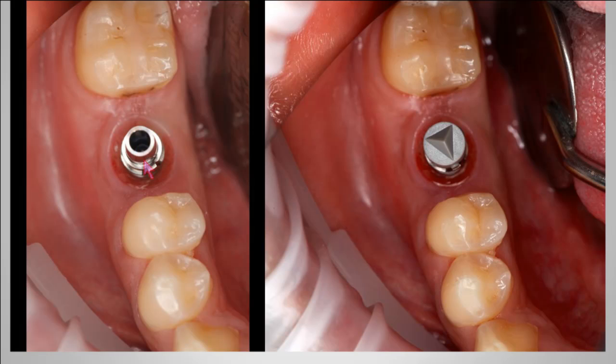Once we've seated this scan post, it's appropriate to take an intraoral X-ray to confirm that the scan post is seated properly. Once it's confirmed, we can then visibly identify this notch and seat the scan body, lining the scan body notch exactly with the notch that's on the scan post. With this component completely aligned, we are now ready to take an optical impression.